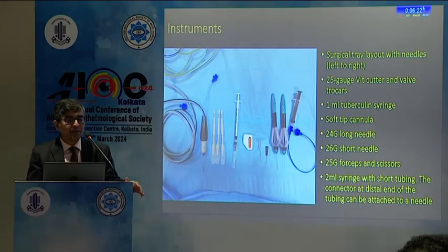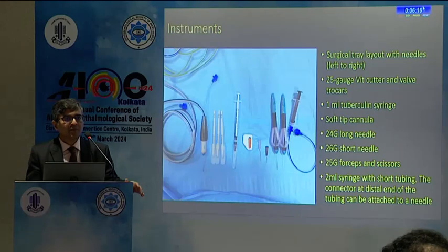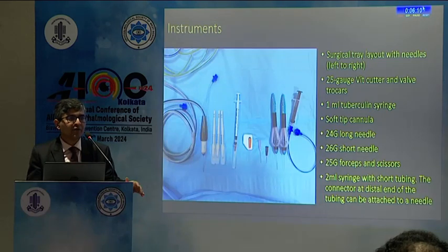We need to make sure that all the techniques and procedures related to biopsies are in place before we do any kind of biopsy. Because once you take the tissue or specimen, it is gold standard, and we don't want to miss being able to get that specimen to the pathologist. So make sure you have everything in place before we obtain any kind of biopsy from the eye.